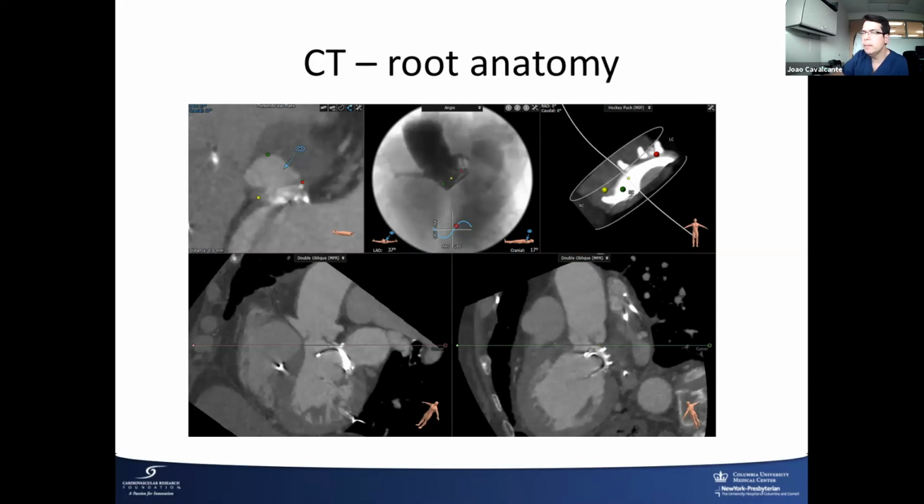I have to tell you that you'd like to oversize the CoreValve on this case, but I don't think your sinuses are going to let you get away with this. So I think we had a debate about that. Our concern with oversizing is it's going to hit here, and that would be too much force and actually pop it up, make it go higher. That was my concern.